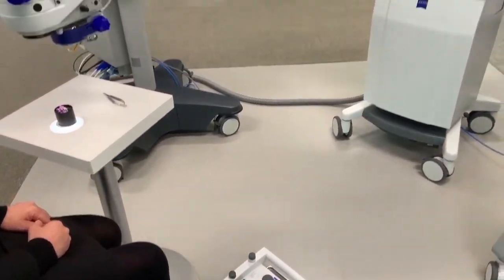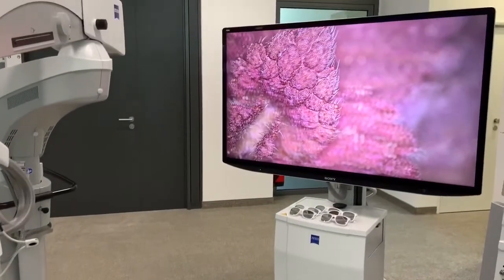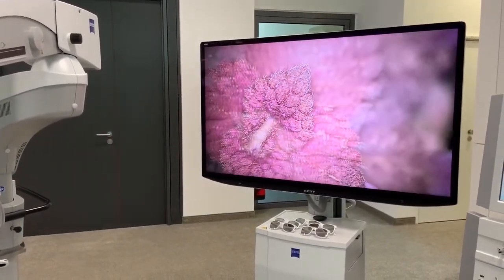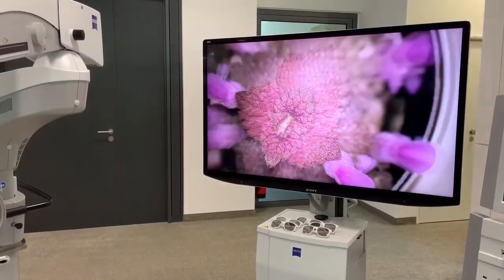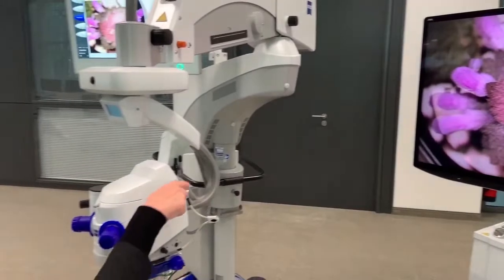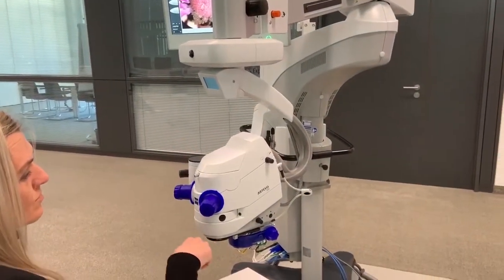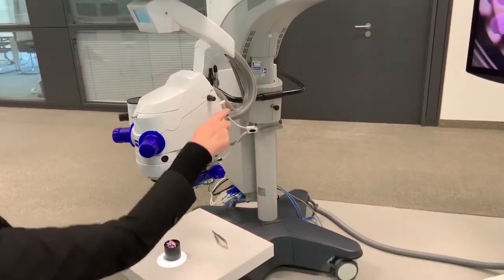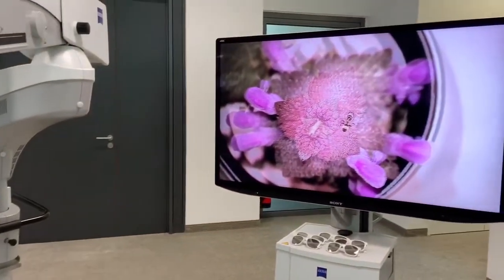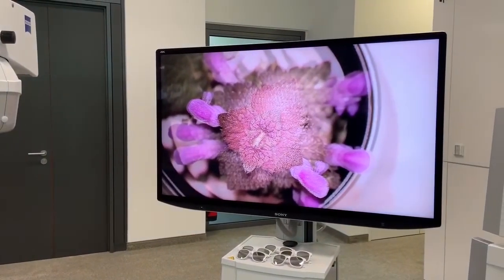Furthermore, it allows you to depict the surgical field in very high magnifications and in a high resolution. Last but not least, digital imaging also enables you to benefit from an outstanding depth of field so that refocusing can be reduced.